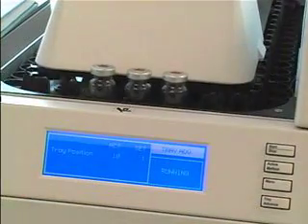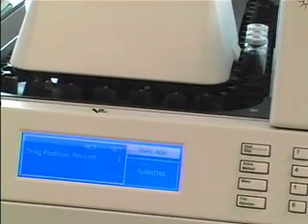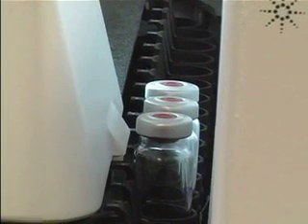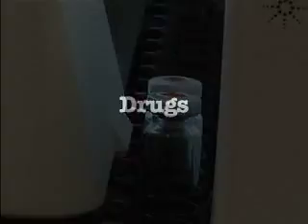Toxicology testing can determine if any of these compounds are present in a sample, and if found, the chemical can be quantitated to help determine whether or not an individual was driving under the influence in a traffic case, or if an individual may have died as a result of overconsumption in a postmortem case.